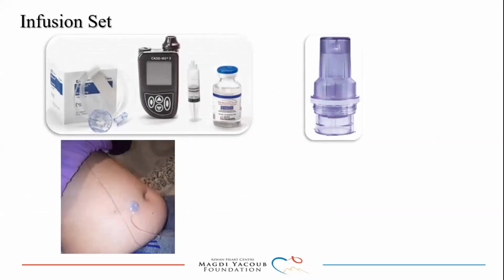This is a picture of the infusion set, just to be familiar with it. With a micro infusion pump, usually the syringe is filled with the drug and placed in a cartridge in the micro infusion pump, then connected to a thread-like catheter at one end, and the other end is connected to the skin.